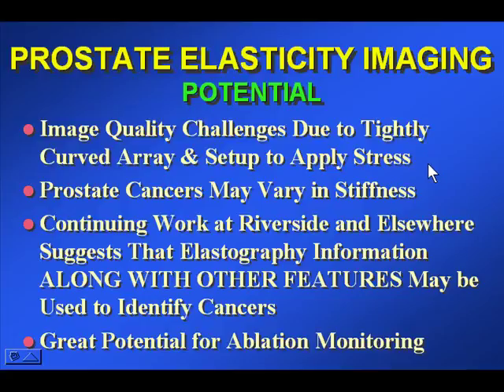Well, what is the potential for prostate elasticity imaging? There are image quality challenges due to the fact that prostate imaging probes are very tightly curved, making it hard to apply uniform pressure to the prostate gland. But these problems may be solvable. Prostate cancers may vary in stiffness. Some cancers are harder than others, and that means that probably elasticity imaging will not be able to reliably image all cancers.